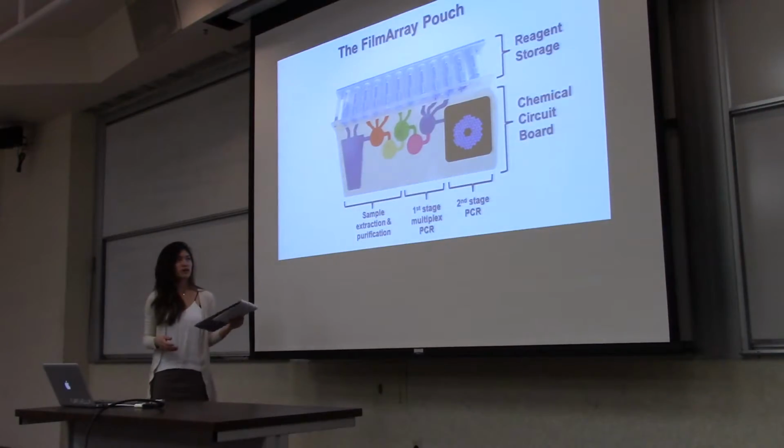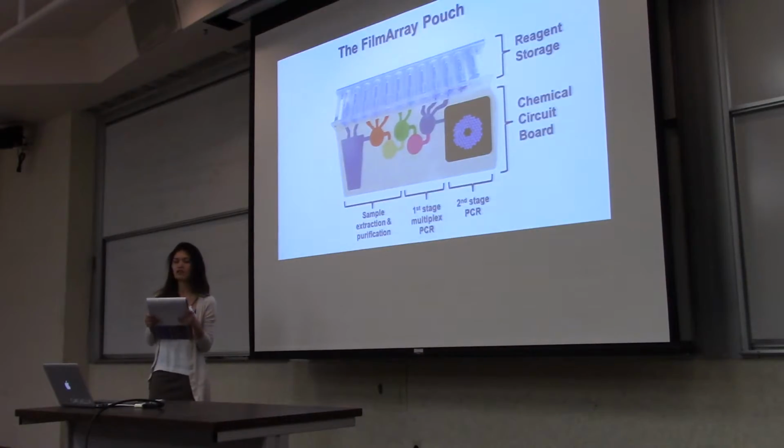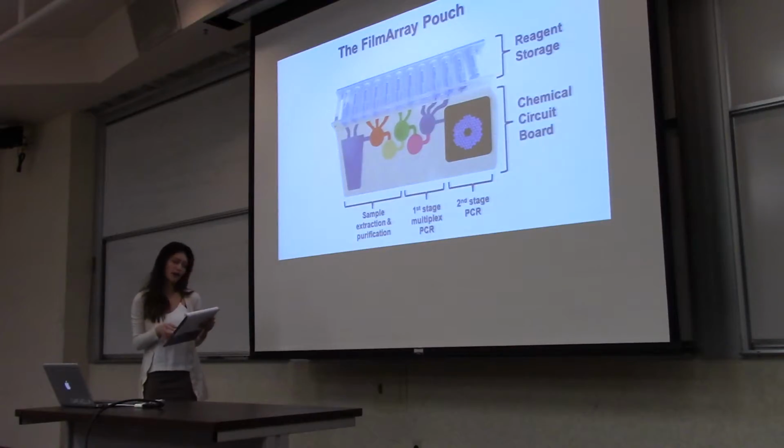And back to the proposed ESP design, as you can see, this is a film array pouch. A film array pouch is a proven technology that can detect 30 DNA targets using the PCR technology within 1 hour in a genetically programmed self-contained pouch. I intend to program detection reagents for the HABs, FIBs, and antibiotic resistance in this program.